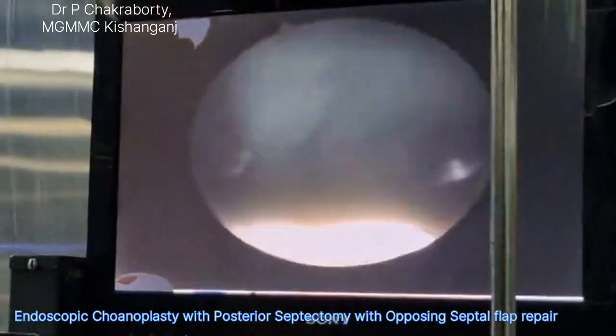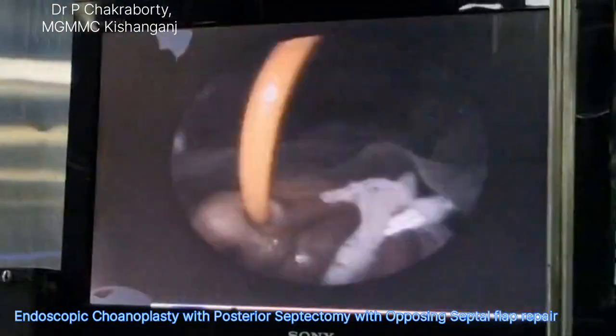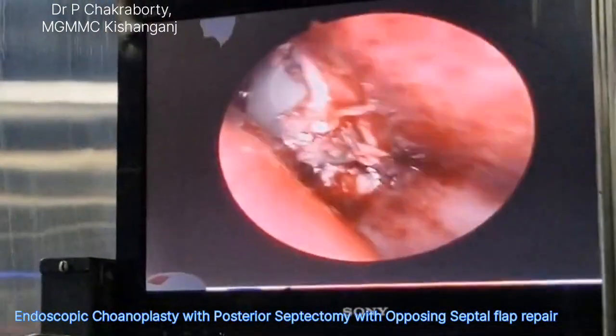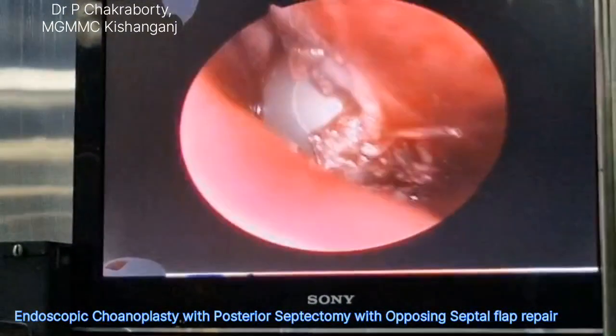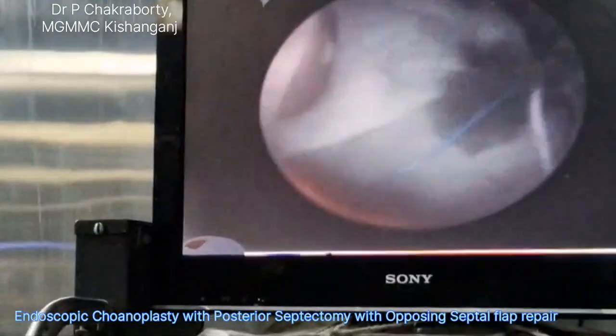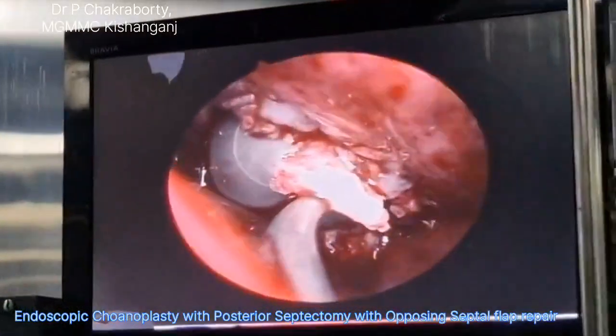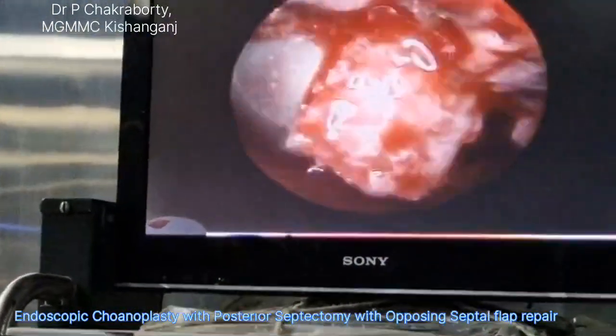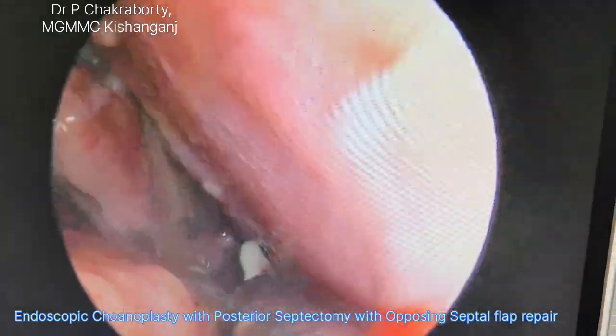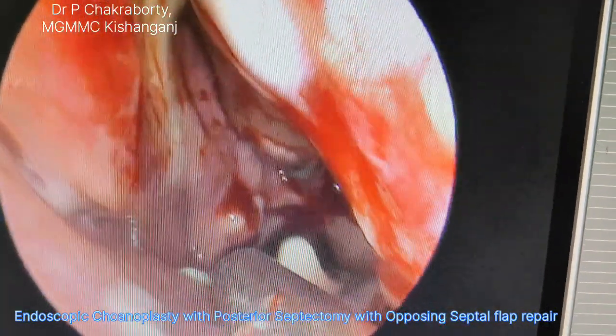As you can see, our work is done. The flap has been deposited, and we are putting a Foley's catheter and inflating the Foley's bulb to keep the flaps in position, and we'll keep this Foley's catheter for 7 days. Remnant of the septal cartilage which was impinging onto the flap has been removed.